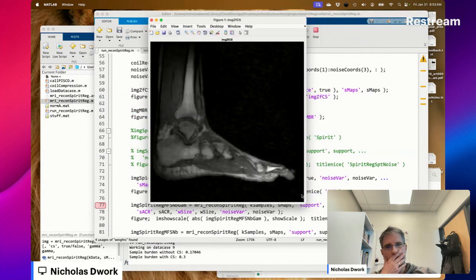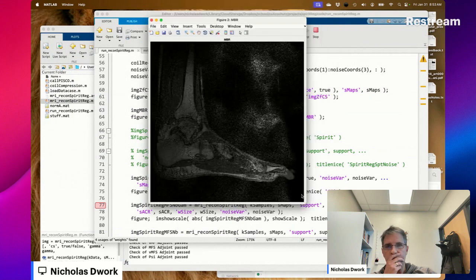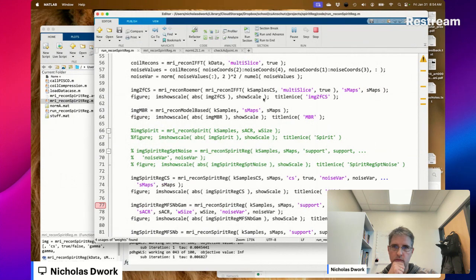That's zero filled. That's model-based reconstruction. That's going to take a long time to get to the compressed sensing reconstruction the way that we're doing it. You know what?